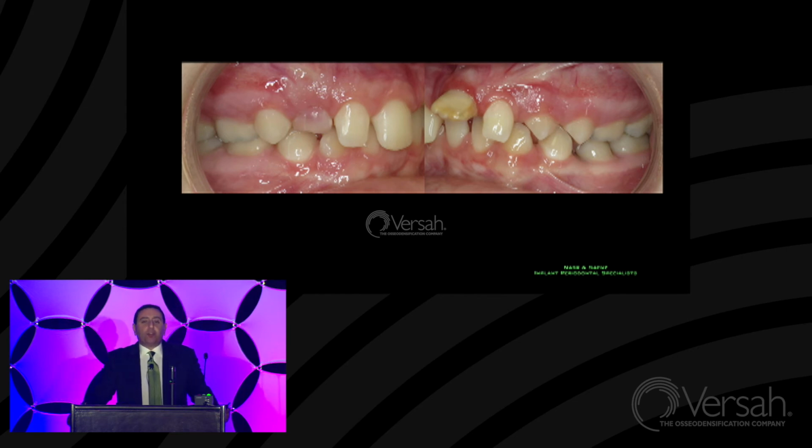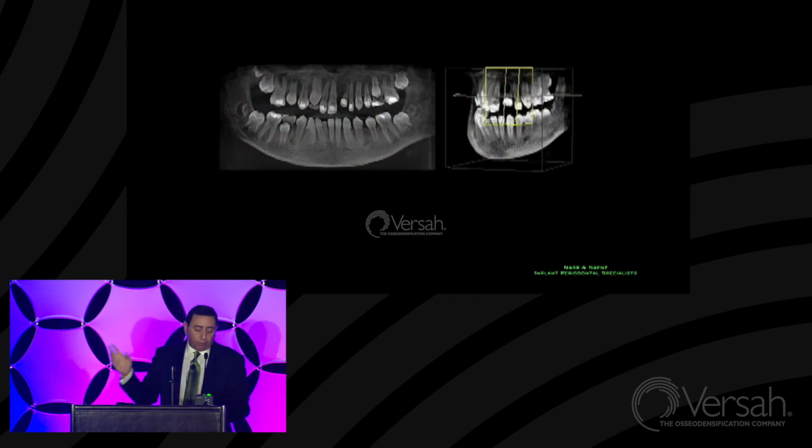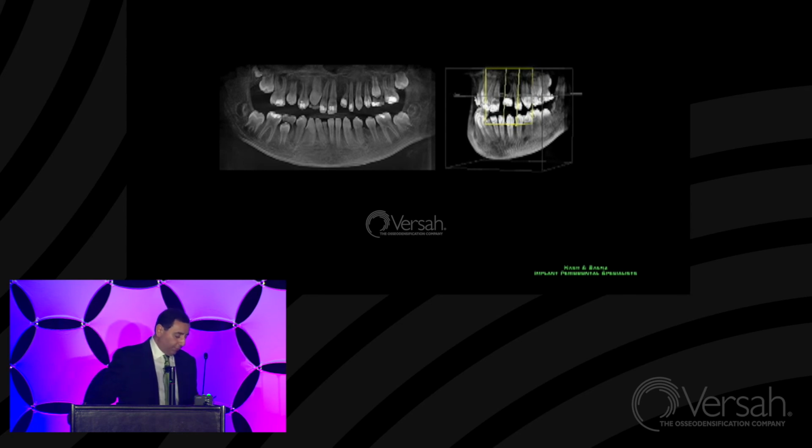He has that supernumerary tooth, which is actually two pieces. There is a coronal looking part, and there is an odontome apical to that that's encroaching on the adjacent tooth. And this is when Caleb came to me prior to the procedure.